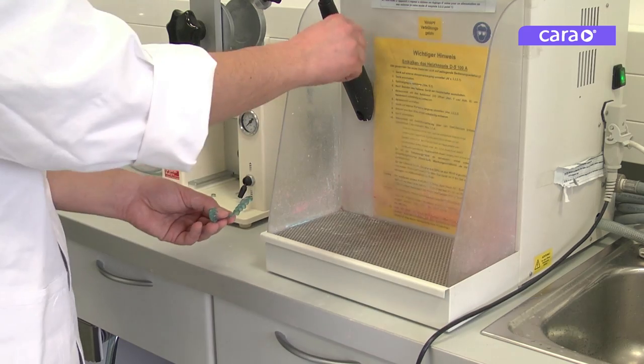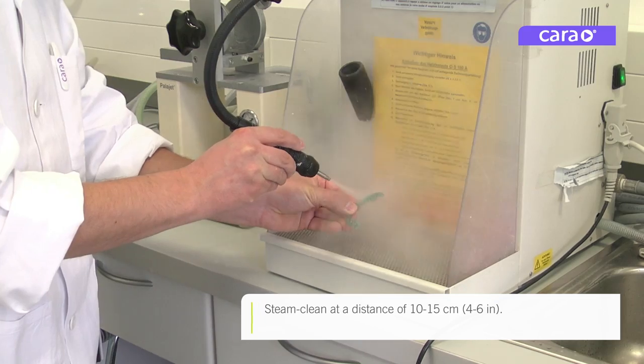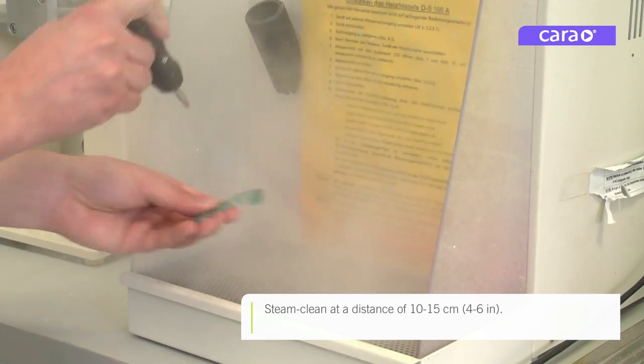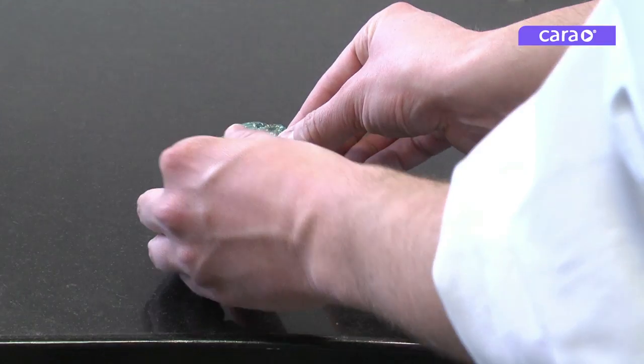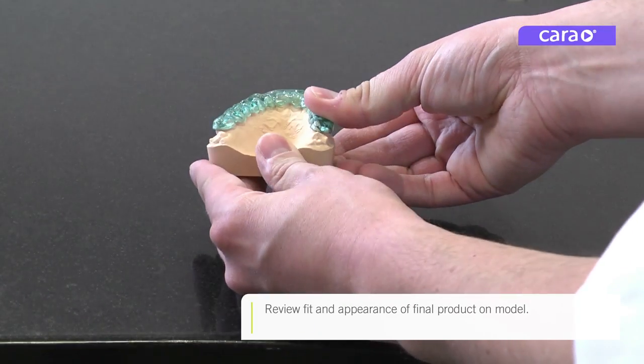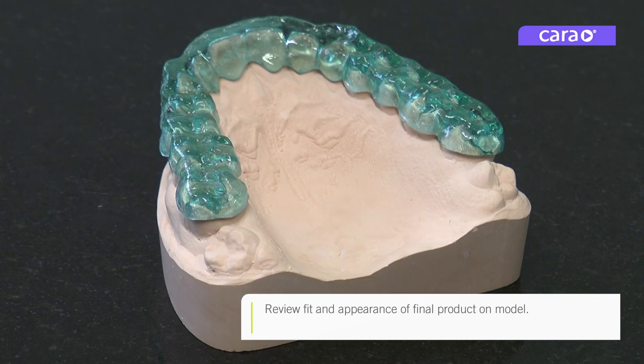Now you can clean the splint with a steam cleaner at a distance of 10 to 15 cm or 4 to 6 inches. Now that it's finished, you can check the fit and appearance of the final product on the model.